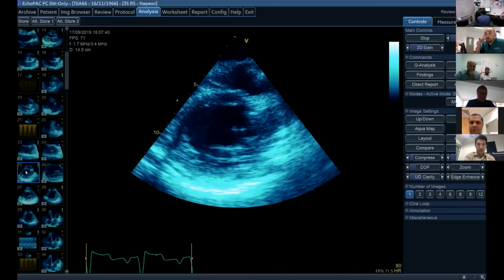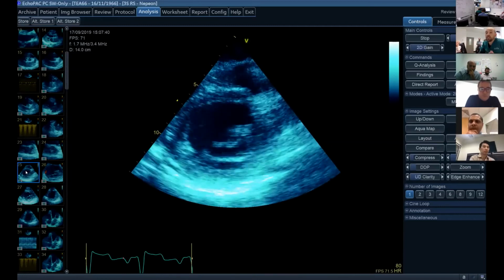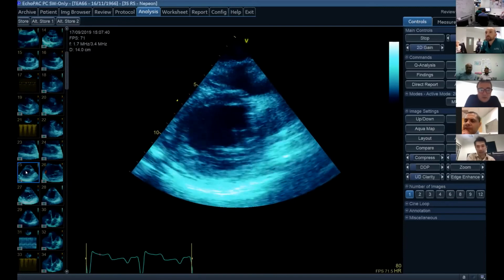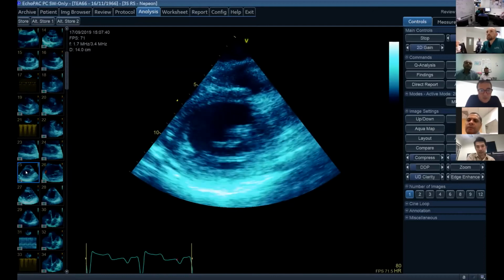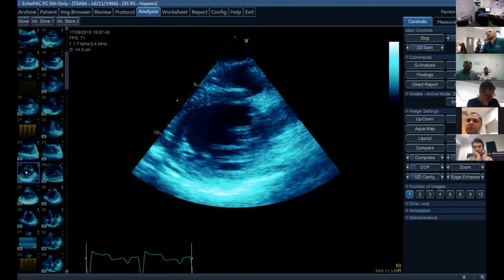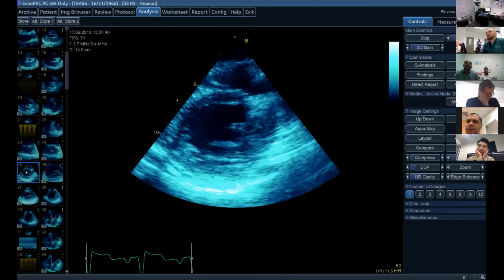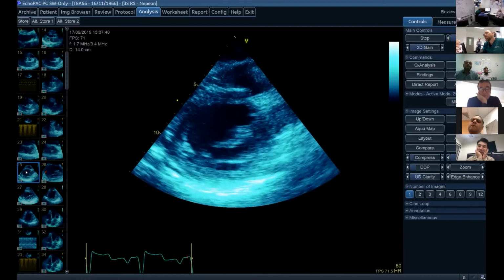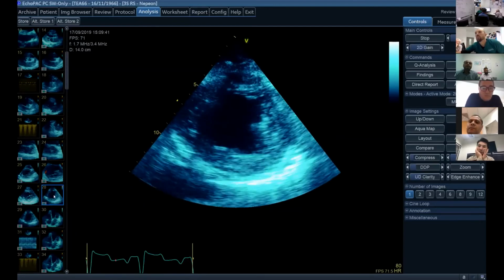Did you just want to go through the parasternal long axis, discussing the grading in terms of wall motion abnormalities? So this is a short axis view at the level of the mitral valve. There is akinesis anteroseptally, anteriorly. Probably hypokinesis anterolaterally. That's all I'm seeing. I'm just seeing one image. Yep. And if I give you the mid papillary level.